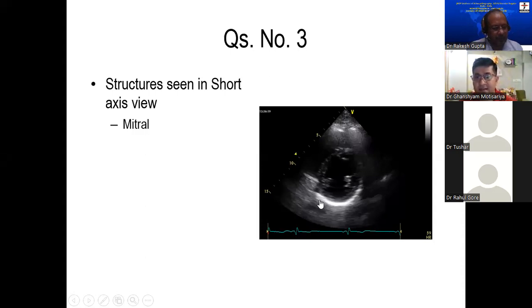That means that whichever papillary muscle is not seen or not contracted, this is ischemic. Pardon? Maybe due to ischemic disease. That is known as papillary muscle rupture. Okay. You will see over a period of time, this is lateral, this is medial.